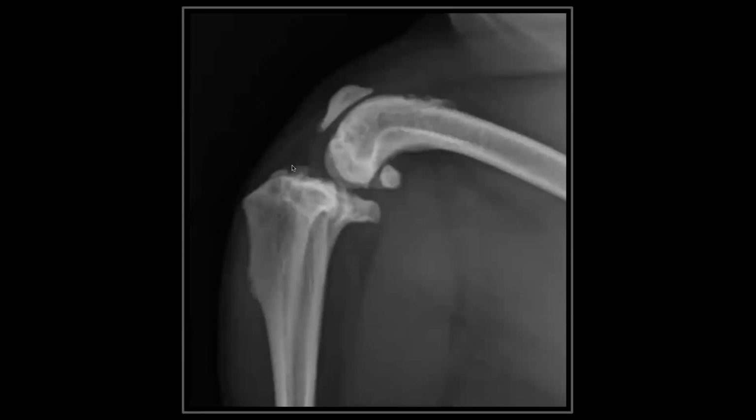This fat pad, which is normally right here, has been displaced, in this case in the dorsal aspect, by fluid that has formed right here below the femur. And it's actually not that uncommon to see a wisp of fluid along the line of the femur. If it's following the contour of the femur and it's just a small wisp, kind of a hair width bit of fluid, that's actually okay. But when we're displacing the fat pad, when it's in an abnormal, uneven appearance, when it's this amount, then that is abnormal. That'd be consistent with a positive test for stifle effusion.